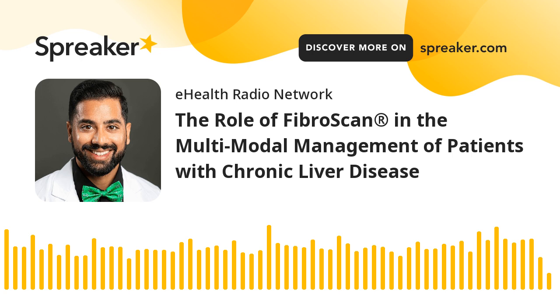Sure. So FibroScan is both a screening and diagnostic point-of-care device that utilizes ultrasound technology to quantify liver fat and liver damage and/or scarring. When caring for patients with chronic liver disease, this device is monumental in completing a comprehensive evaluation. Now, from a hepatology standpoint, it is not only important to determine the etiology of liver disease, but also the extent of existing damage. It is a tool used to monitor progression, as well as healing and improvement. These are just a few of the various reasons I decided to implement this in my own practice.